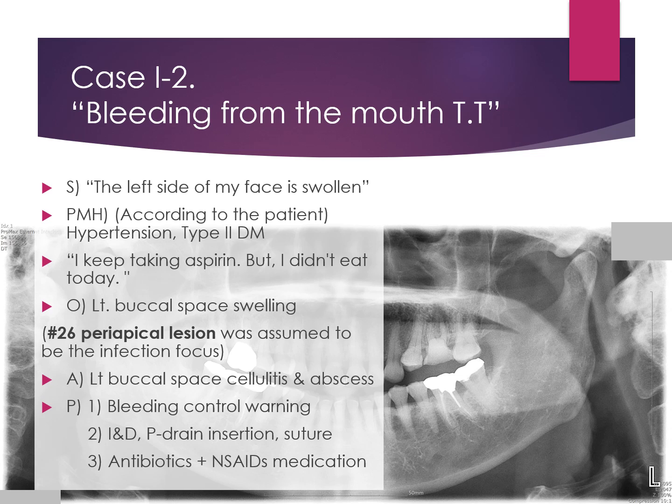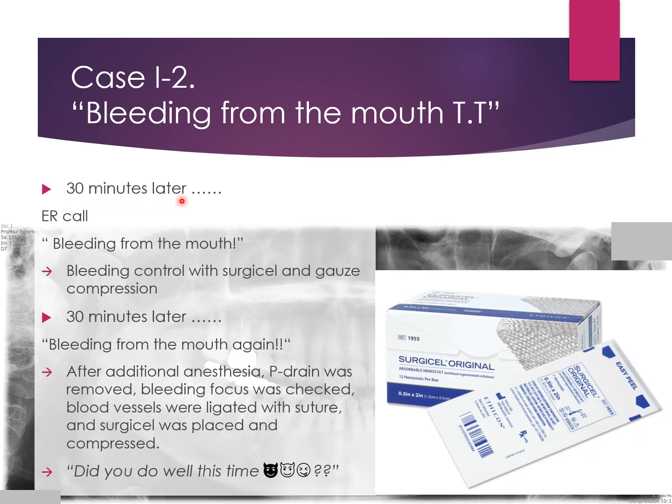Thirty minutes later, I got a call from the ER. Bleeding from the mouth. I performed bleeding control with Hemostat and gauze compression. And another 30 minutes later, I got a call from the ER again. Bleeding from the mouth again.